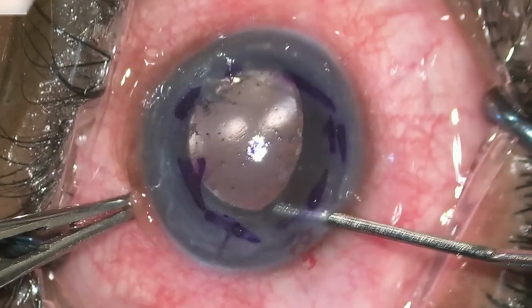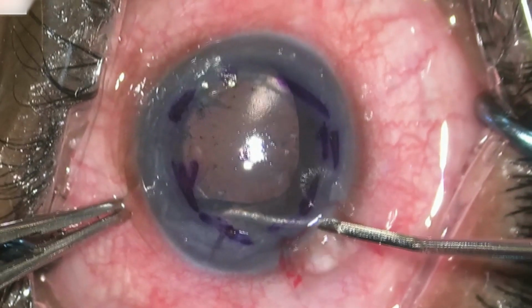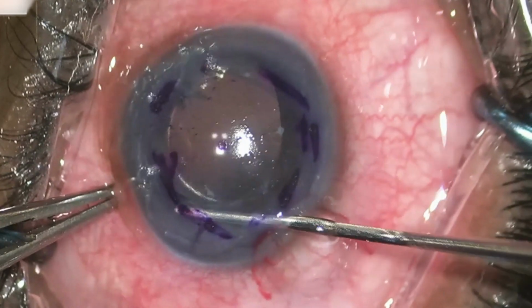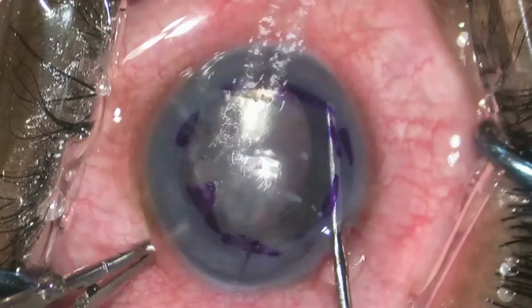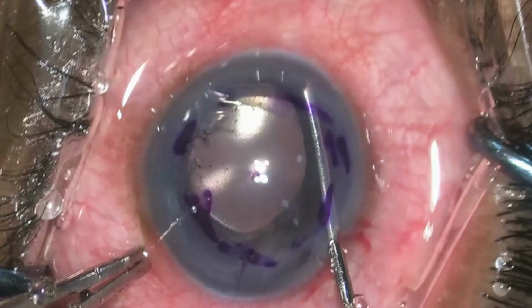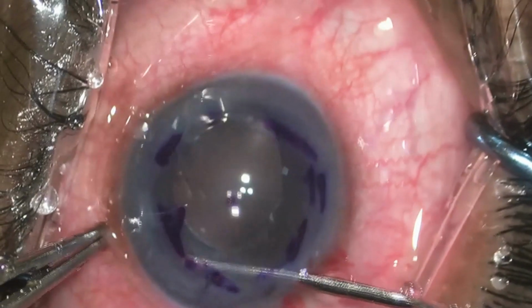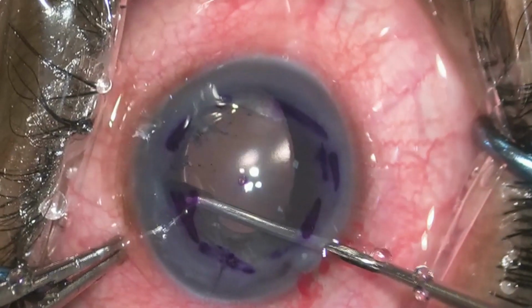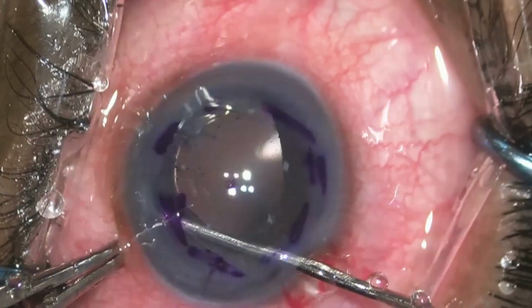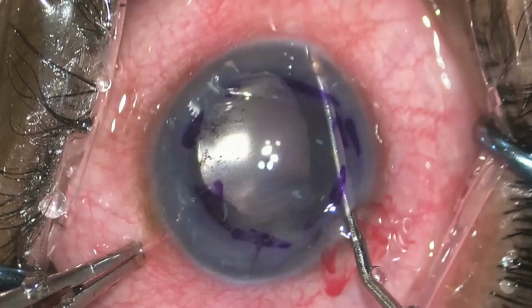Iris repositor is used to break the anterior synechiae. Maneuvering of the instrument to break the synechiae is done in such a way so that there is minimal stretch at the root of the iris, so as to prevent iridodialysis and bleeding from the angles. Gentle stripping with the iris repositor is done at the angles to break the peripheral anterior synechiae.